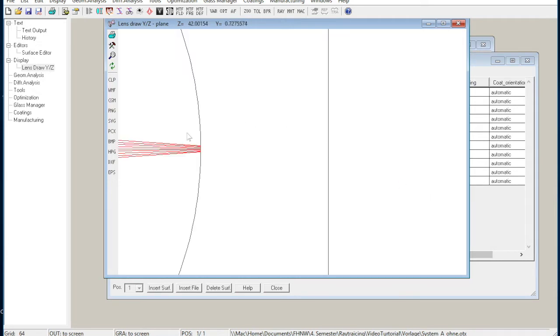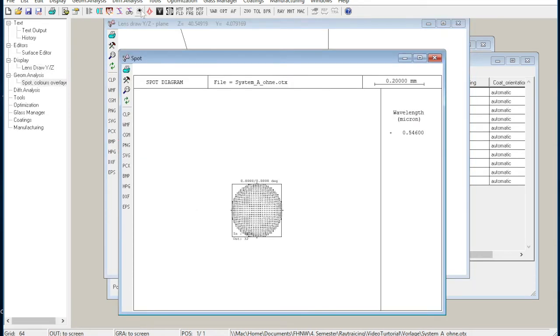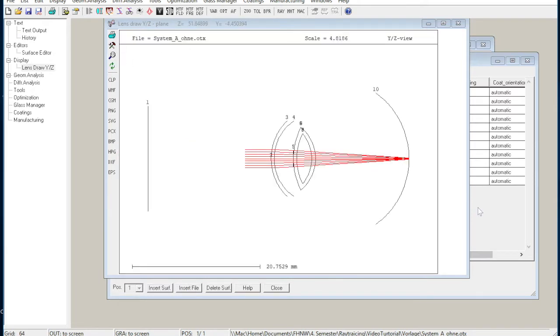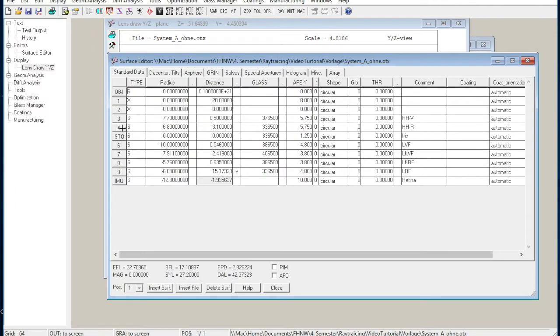We haven't got a nice focal point, which you can also see here in the spot diagram. It is obvious that we don't have a nice depiction. What we're going to do next is to correct the eye. Therefore, we need a spectacle lens. We try to imitate a pre-made stock lens. So we add two surfaces.